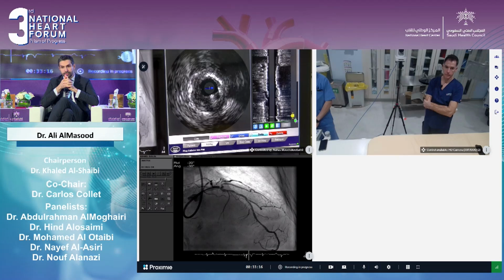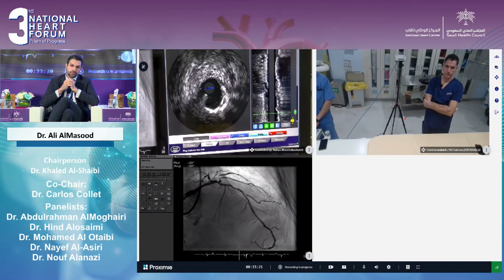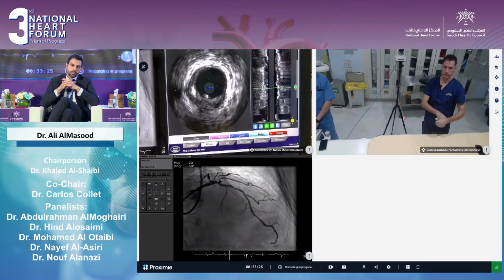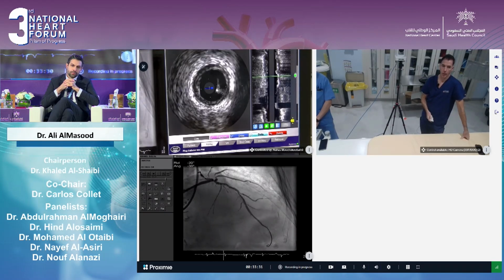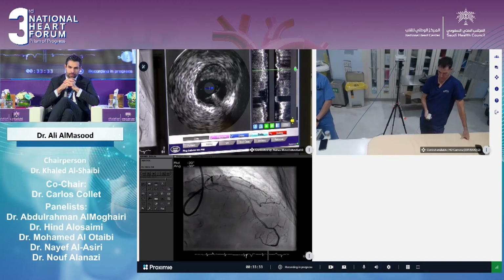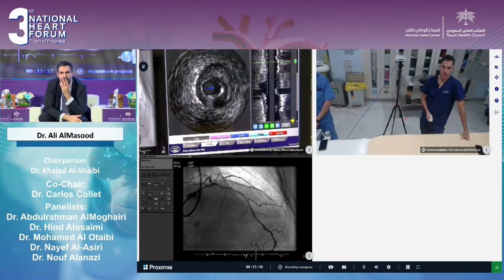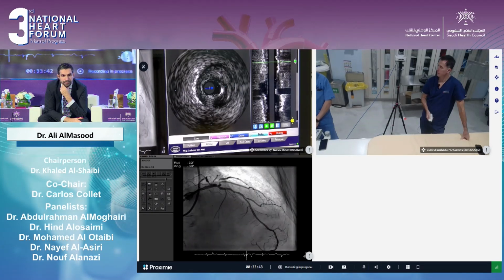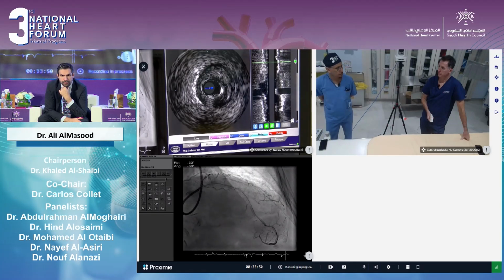The distal left main is tight too. The minimum lumen area was 3.4. And then there is the segment of the proximal, mid and distal. This is mid left main, which has mild atheroma, then there is at least moderate atheroma in the ostial left main, as you can see, and probably you can appreciate how tight the very ostial left main is. So eccentric calcification in the mid, distal and proximal LAD, and tight stenosis in the distal and proximal left main.